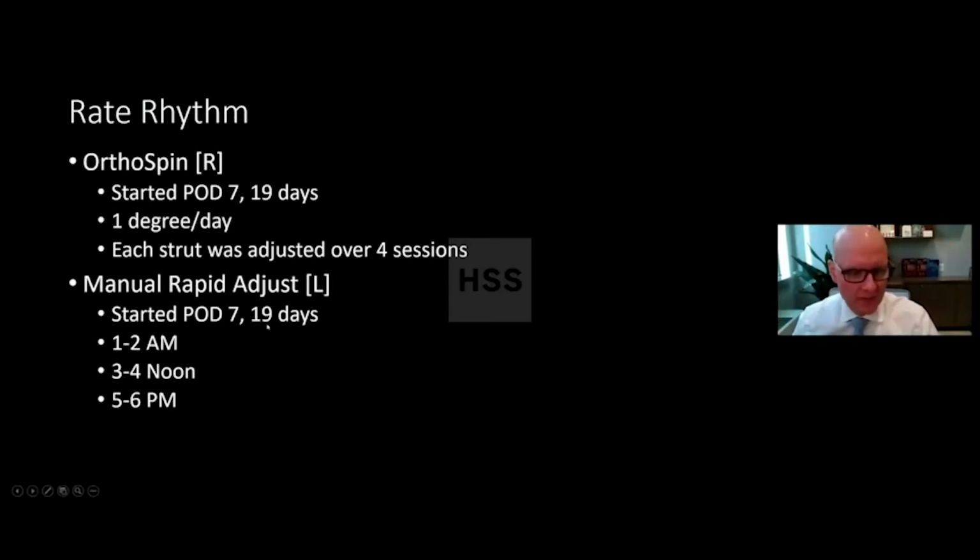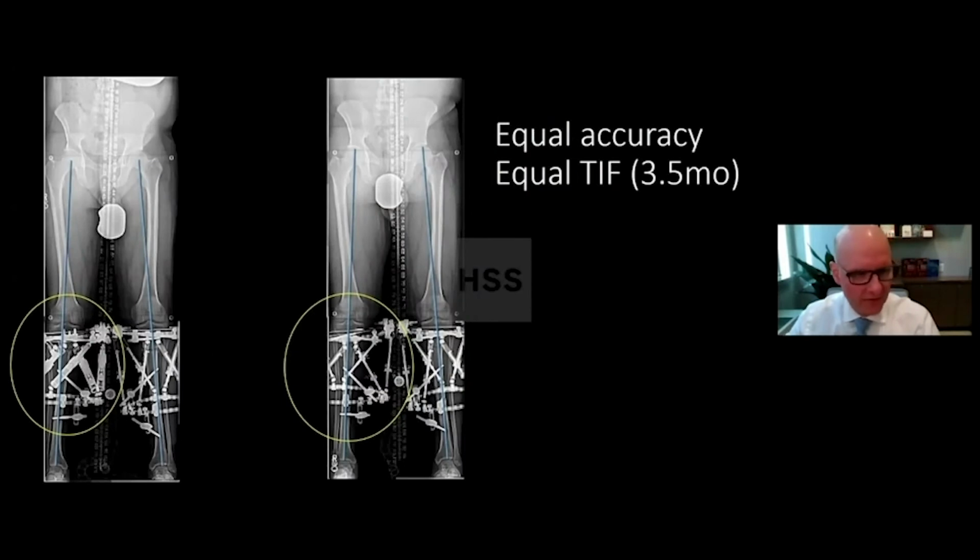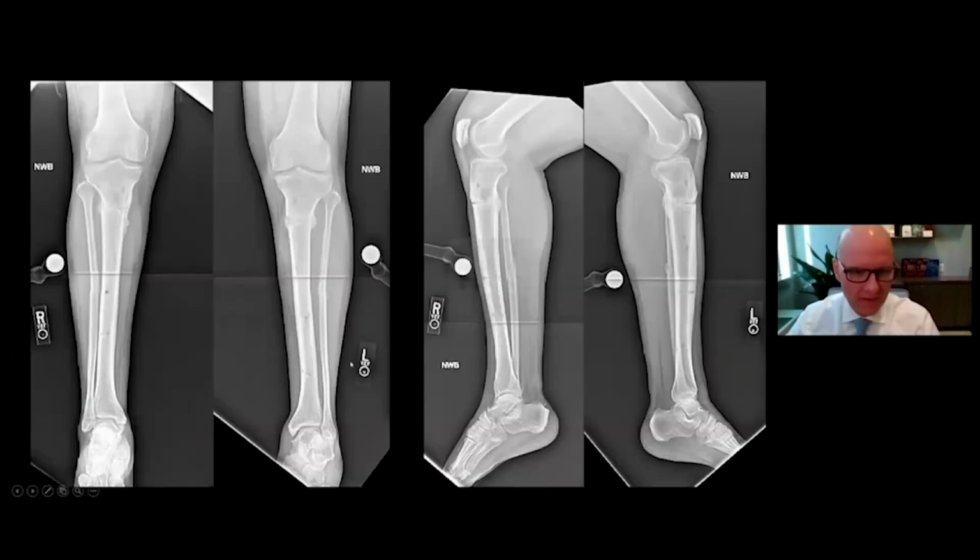The manual struts started post-op day 7, 19-day schedule. Struts 1 and 2 adjusted in the morning, 3 and 4 in the afternoon, 5 and 6 at night, kind of the typical way we've been doing this. Here we are at the end of correction, and here's the frames at the end of correction. We use the usual method of intraoffice standing x-rays to look at mechanical axis, the slight overcorrection because he had a little bit of medial disease. And so at the end of distraction, we were changing the struts back to manual struts. That was part of the protocol at that time.